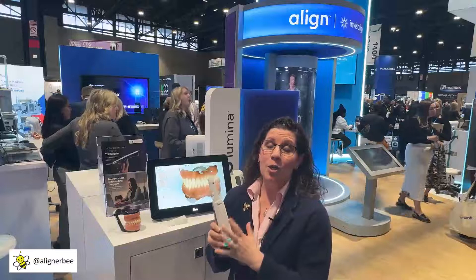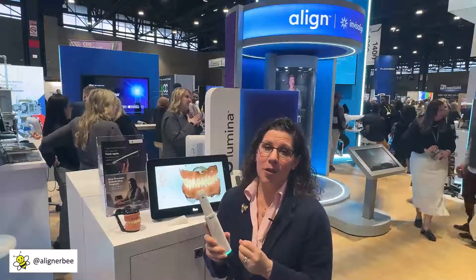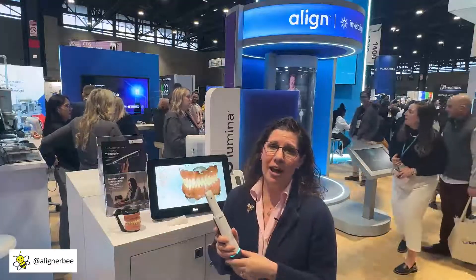The first point is the new wand design. As we can see, it is significantly smaller, so that is a great pro for a lot of doctors and team members that have smaller hands.